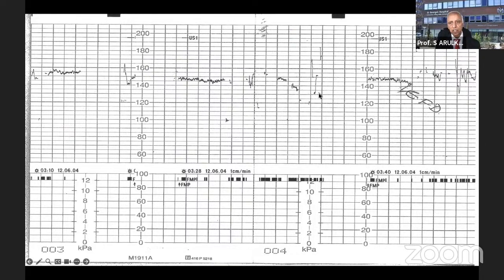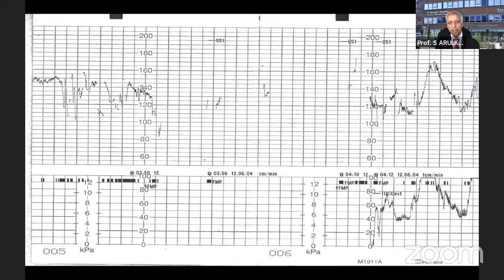They said on vaginal examination she was fully dilated, but they readjusted the transducer because the CTG heart rate was not recorded well with the contractions. And when they readjusted, the heart rate was different. This is 140, it became 120. And with the contractions, if we draw two lines at the same time of the contraction, the heart rate is going up. So this is maternal heart rate.